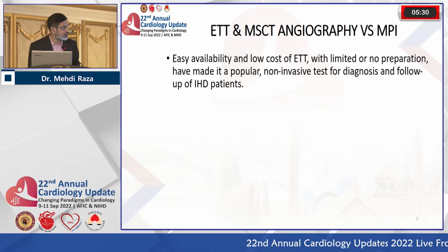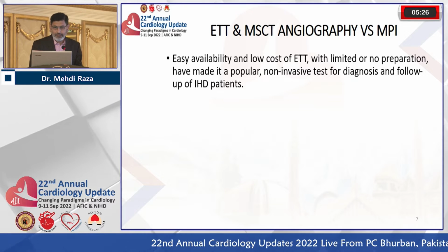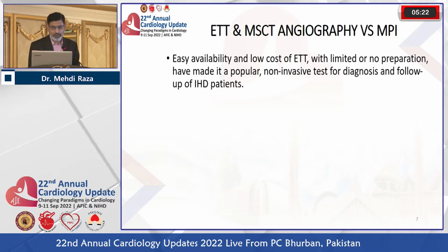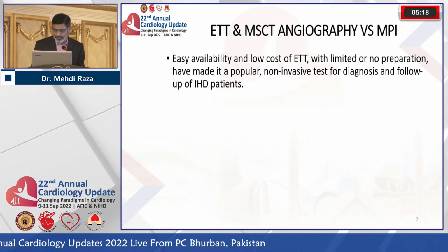We start with ETT, the conventional screening modality. It's low cost, limited or no preparation, and this has made it a very popular non-invasive test for diagnosis and follow-up of ischemic heart disease patients.